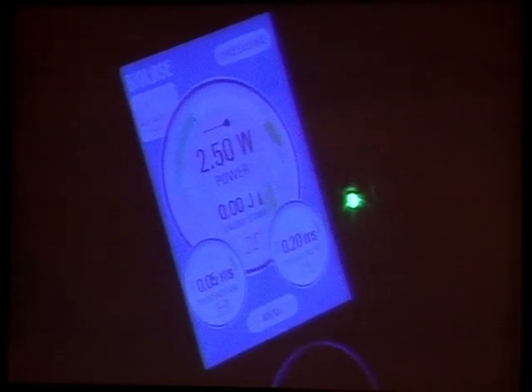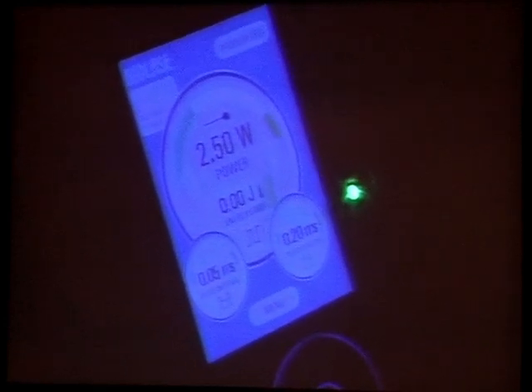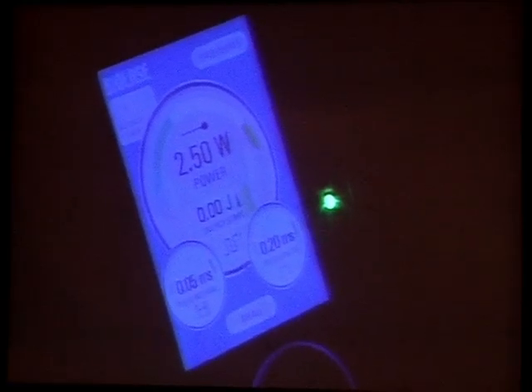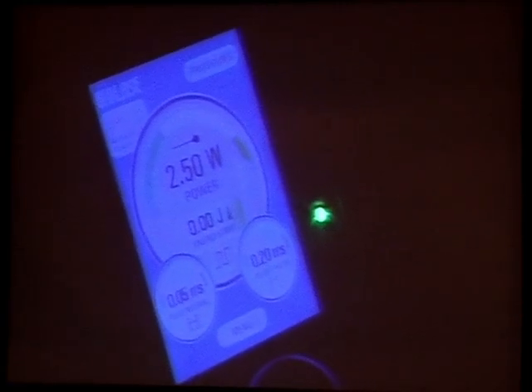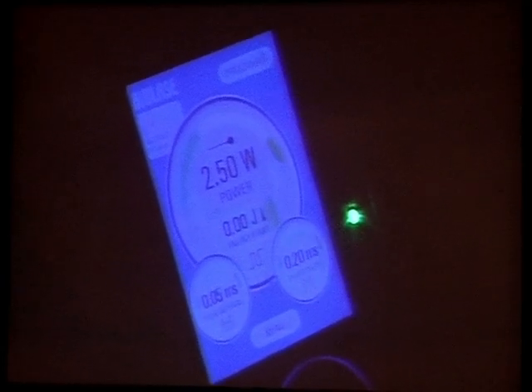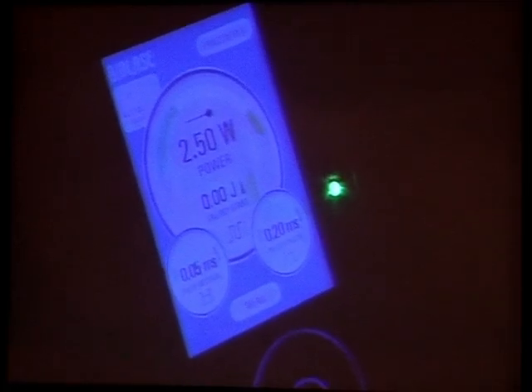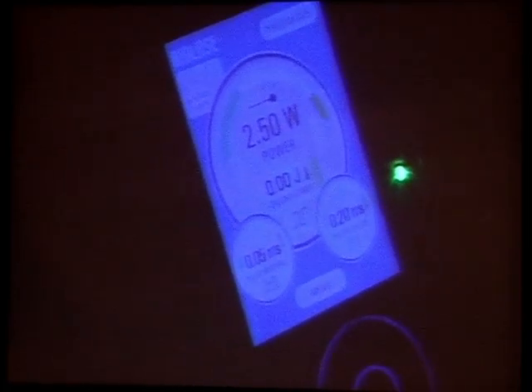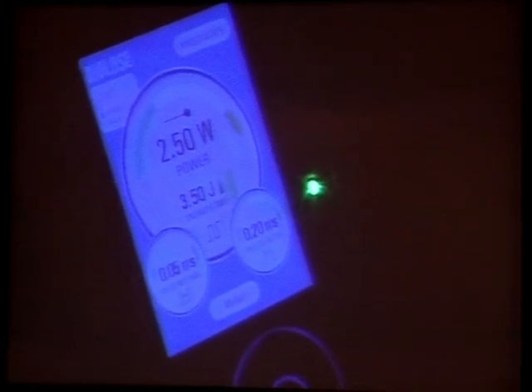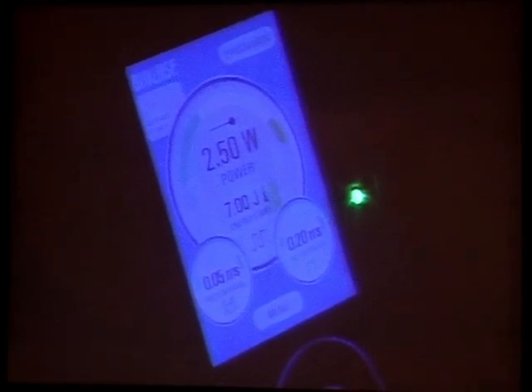So now that we know that the average power here is 2 watts, because we are shutting off the lasing 25% of the time. So if this power is 2.5 watts, it's actually working at 75% duty cycle, and therefore it's 2 watts of power. Now, if that interval was 0.20, then it would be 1.25, would be the effective power of the lasing, okay? So that's something that you will have to worry about.